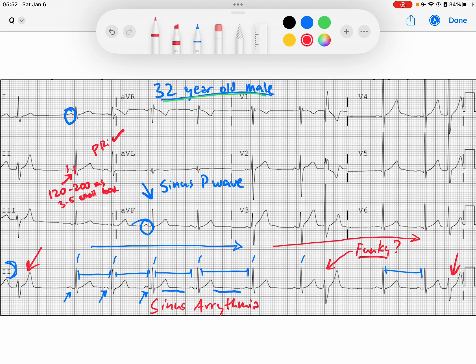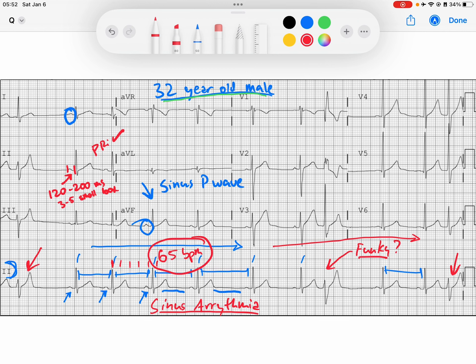This is a really good example of a common finding we see especially in young, healthy individuals — something called sinus arrhythmia. Sinus arrhythmia is variation in the heart rate with inspiration and expiration. The true mechanism behind that involves changing intrathoracic pressures — I've got another video on sinus arrhythmia. So this is a normal finding. Looking at our rate: 300, 150, 100, 75, 60 — somewhere around 65 beats per minute, exactly what we'd expect from a sinus node. All very reassuring findings.